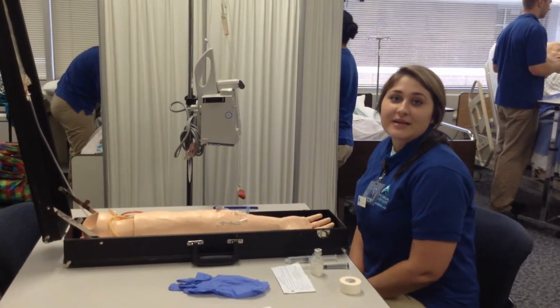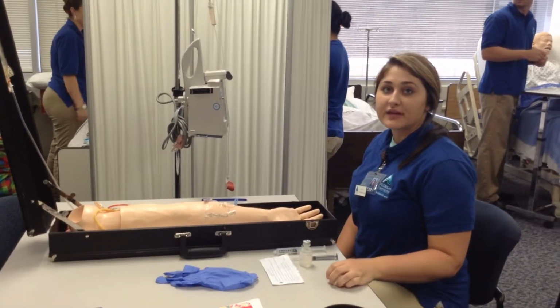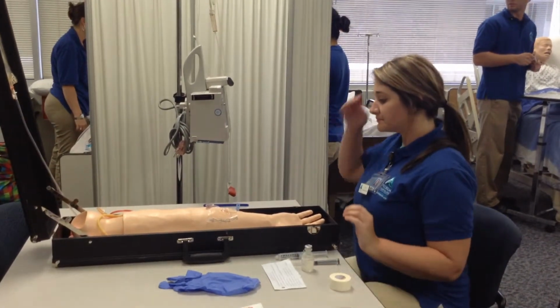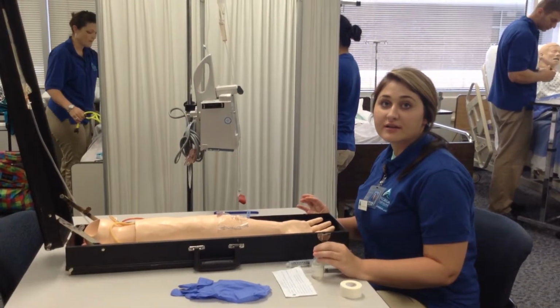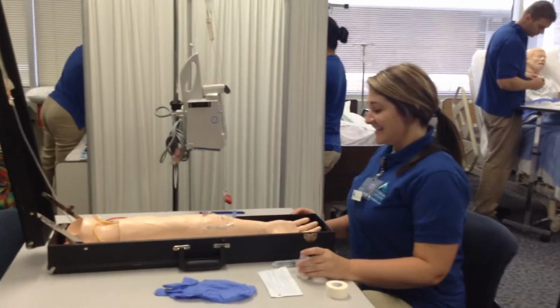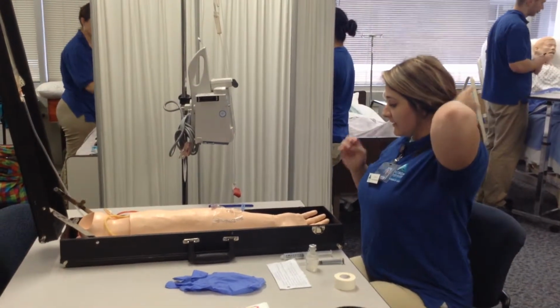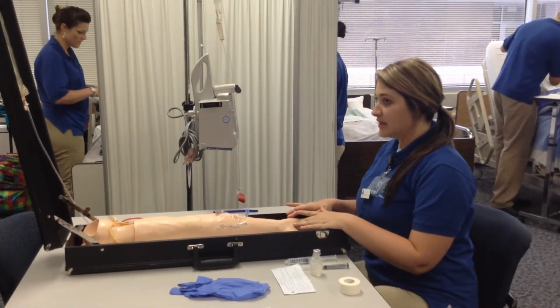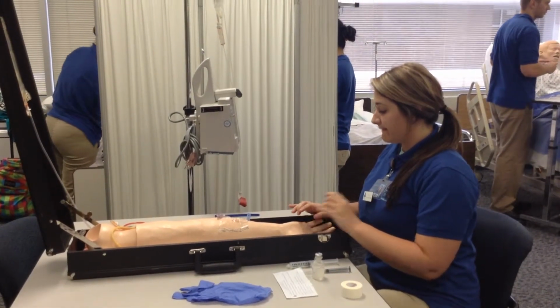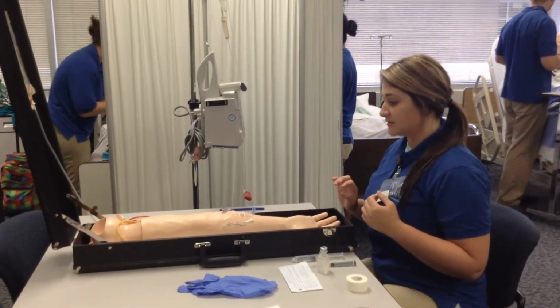Name is Jenna Jones. I am an FACJ nursing student, and I am doing a piggyback IV with a mini bag. I'm going to start by verifying the doctor's order against the patient's MAR, checking for allergies. I'm going to verify the correct dose, route, and frequency of the IV. I will assess the correct lab values and data, and of course, the patient allergies.